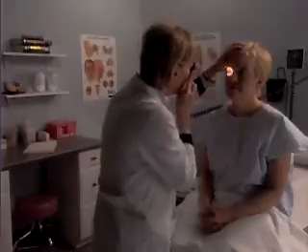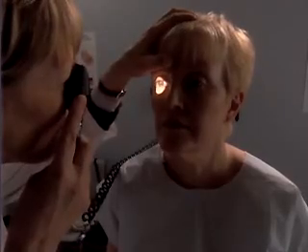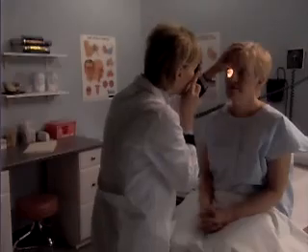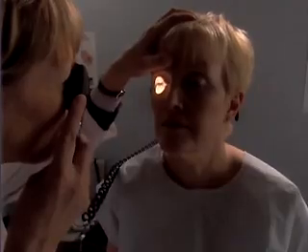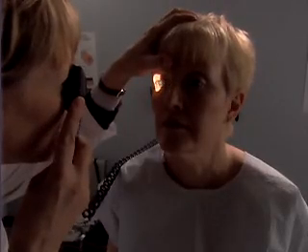Remember to use your right eye and right hand as you examine the patient's right eye. From 15 inches away and 15 degrees lateral to the patient's line of vision, shine the light beam on the pupil. Placing the thumb of your other hand over the patient's eyebrow may steady your approach and allow closer examination. Locate the red reflex, which should appear as an orange glow in the pupil. Note any opacities that interrupt the red reflex.